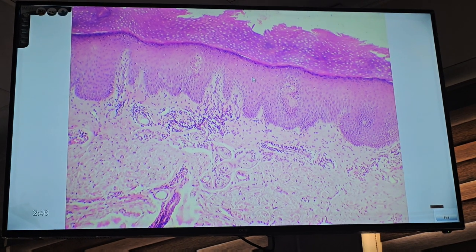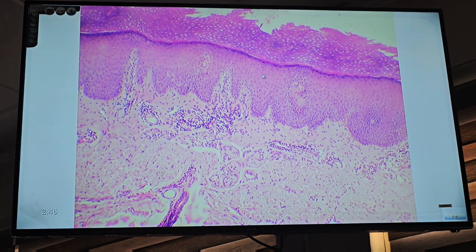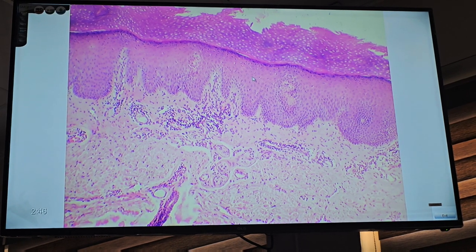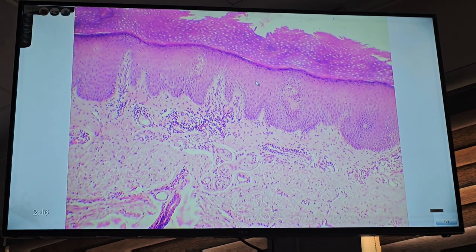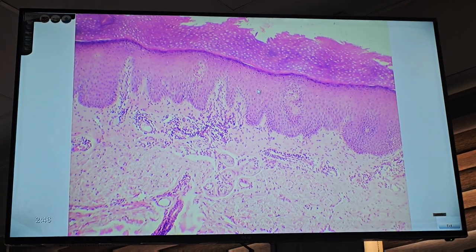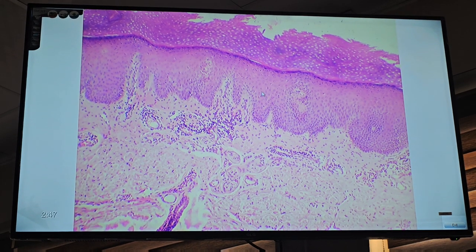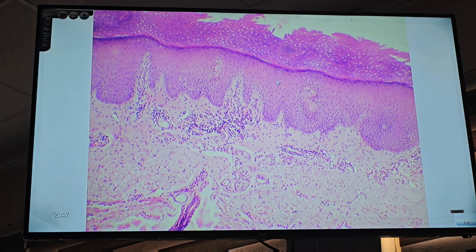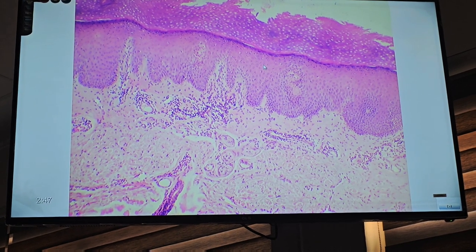The cells extend on the desmosomes, giving the layer the appearance of spines or prickles, so this layer is called the spinous layer or stratum spinosum. The cells of this layer are polygonal in shape. Each cell has a centrally placed nucleus.